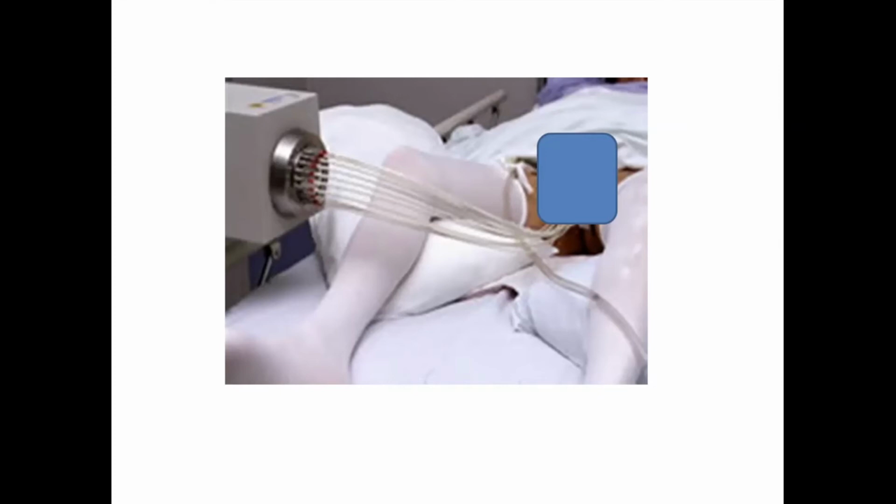And then once that treatment is finished, the tubes can come out of the prostate. So about 15 or 20 tubes are pulled unceremoniously out of the prostate gland with a bit of gas and air, a bit of Entonox and painkillers as required, because that can be probably the most uncomfortable part of the day, in fact, because the anesthetic is starting to wear off, but it only lasts about 2 or 3 seconds. So most people squirm briefly and then relax because everything's done and the tubes are out.